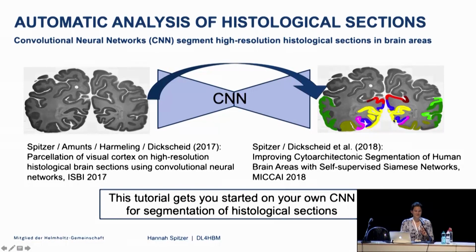That sounds very easy if I put it like that. However, it's a bit more involved, and there are actually a lot of technical difficulties that you run into. You're very welcome to check out our related publications that I put down here on this subject, on how we precisely started to solve this problem. I'm not going to talk about these models today because I would like to get you started on training your own convolutional neural network for the segmentation of histological sections.